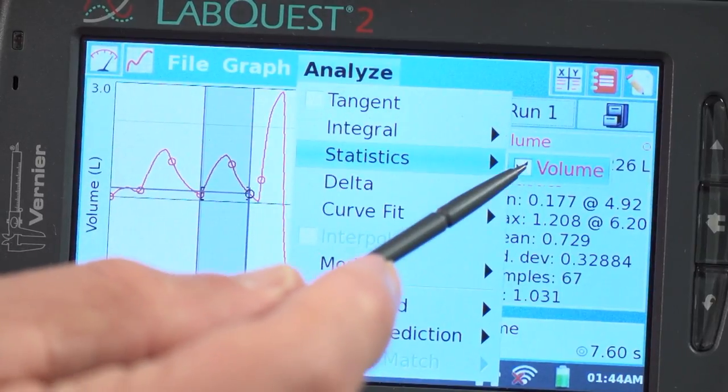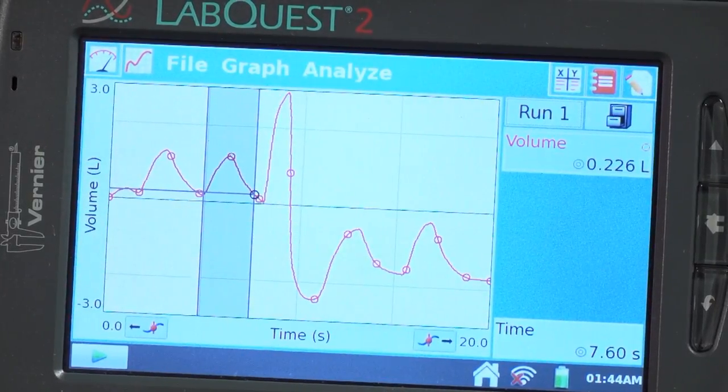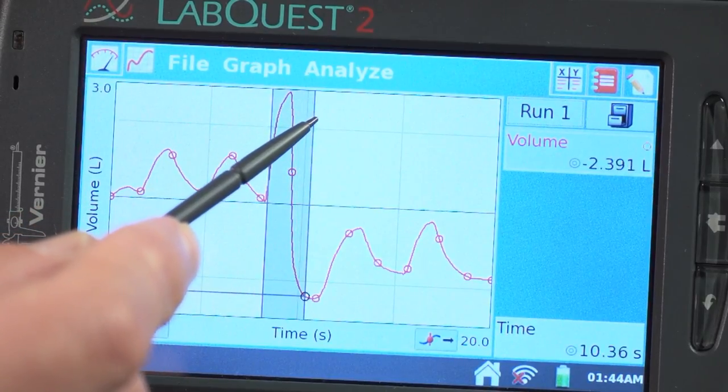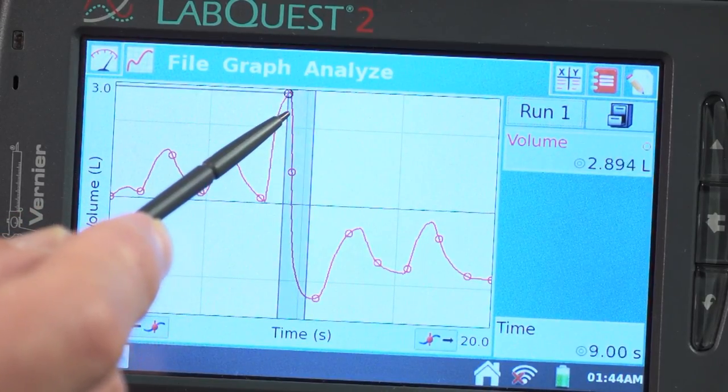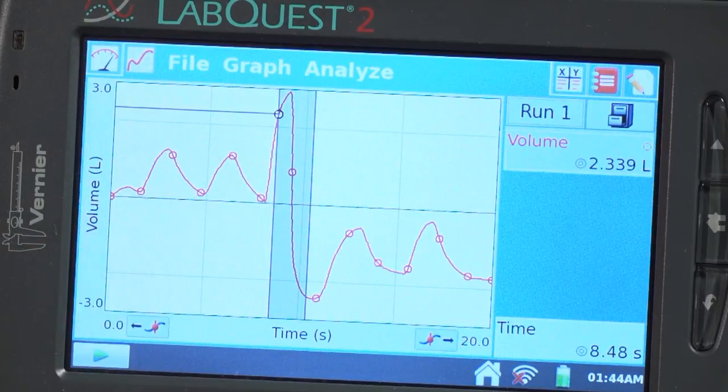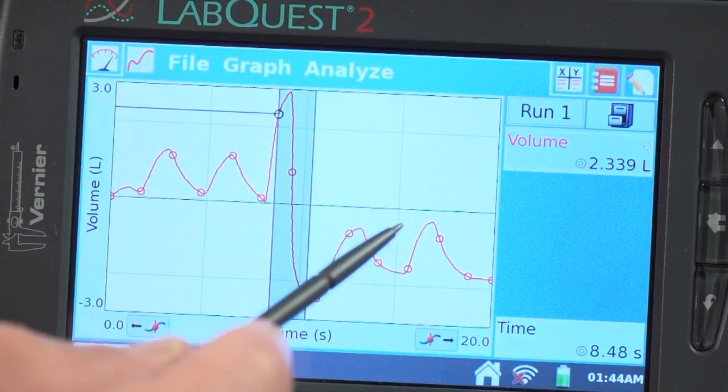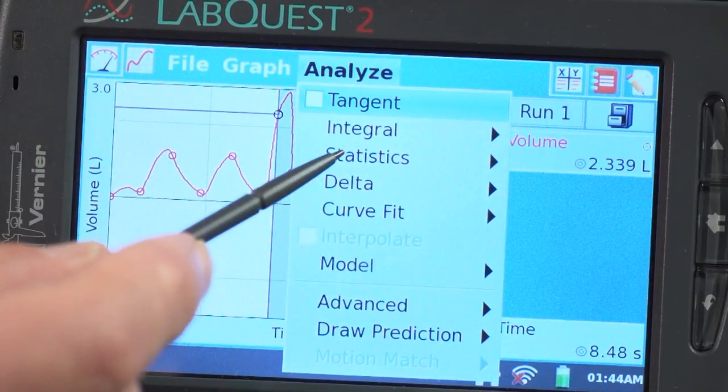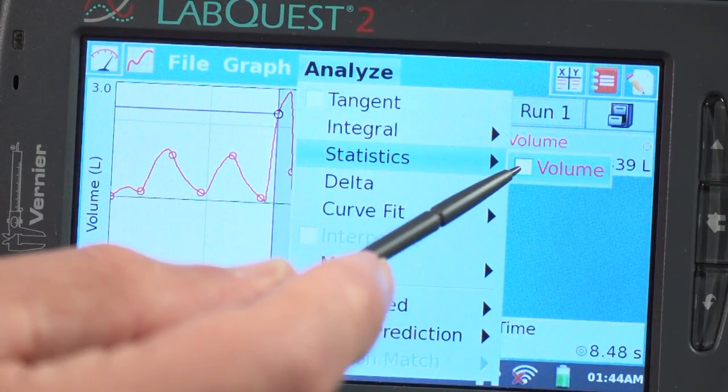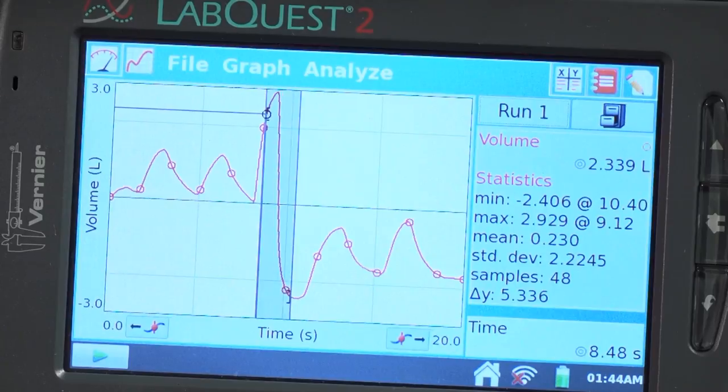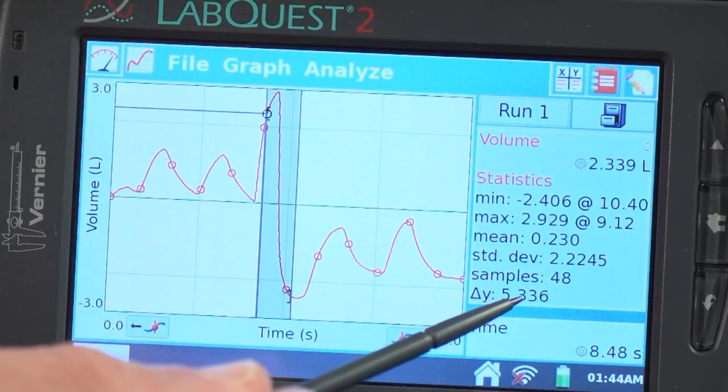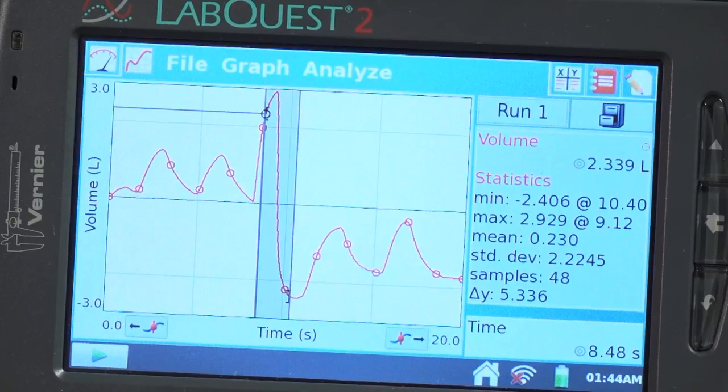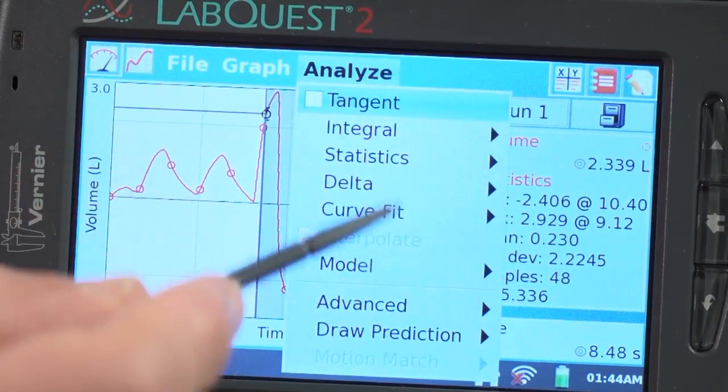So let's turn that off again. And just look at my maximal inhalation and then exhalation. So we can go from this whole region about here to here. Let's go to Analyze again, Statistics, Volume. And the delta Y is 5.336 liters. I'll just turn that off again.